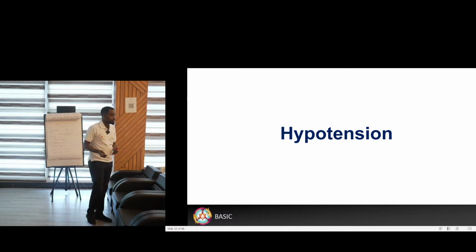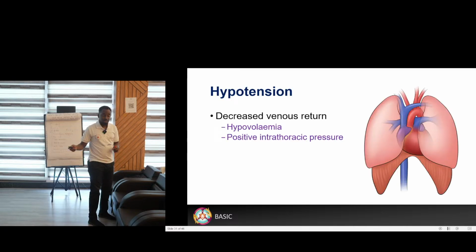Okay. Hypotension. Hypotension in a patient on a mechanical ventilator. Seeing through your monitor, the patient's blood pressure is now dropping.